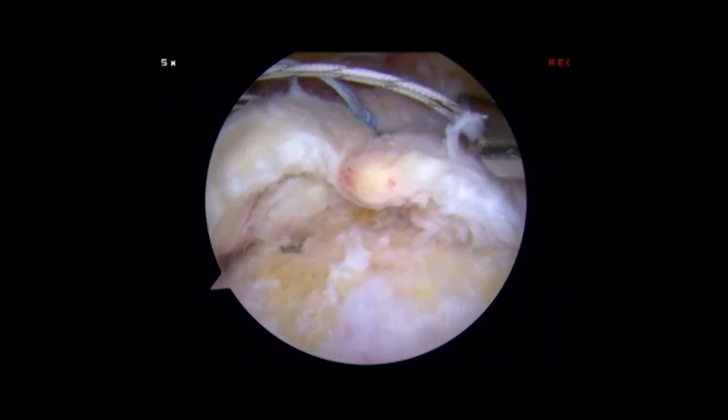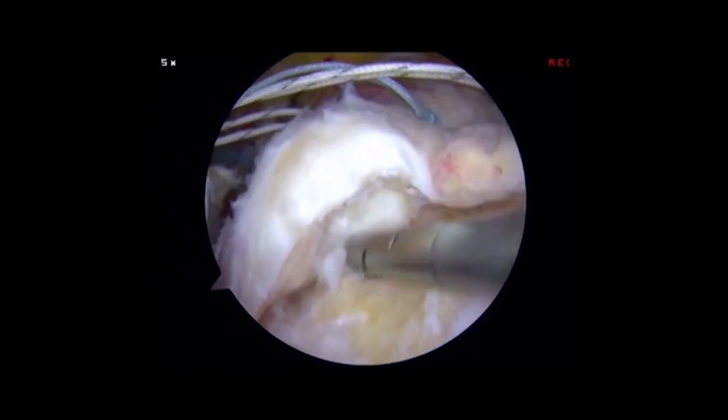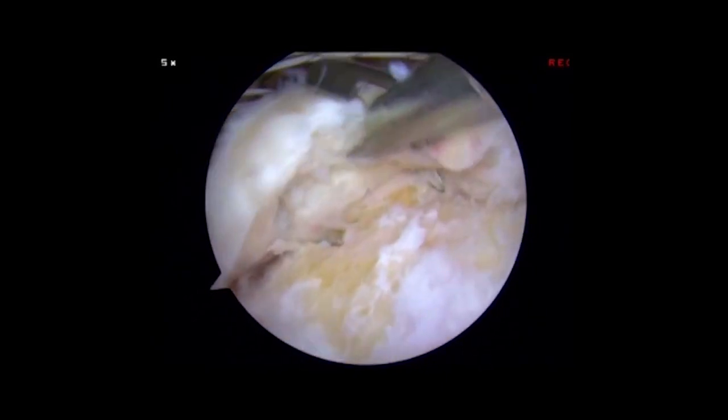These sutures have now been tied, and note that the remaining more lateral cuff, when reduced with this grasper, is reduced to a more appropriate anatomic footprint and is not overly lateralized.